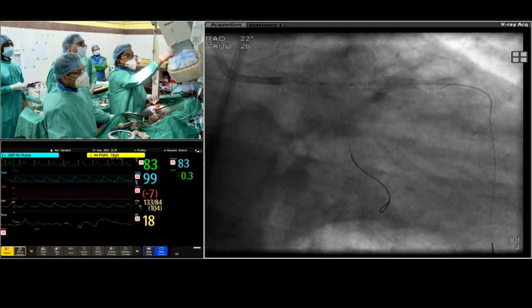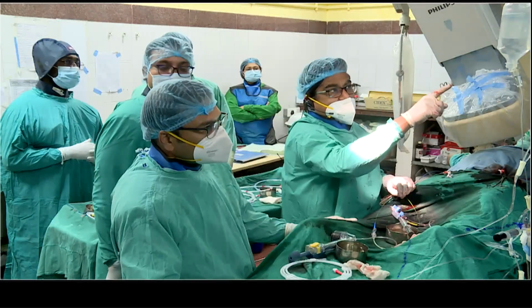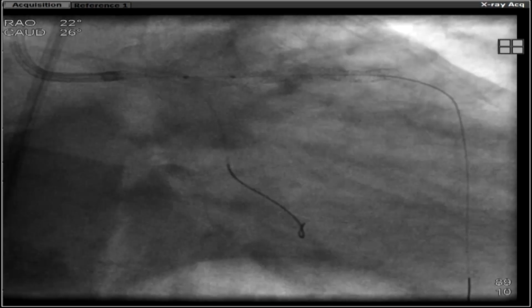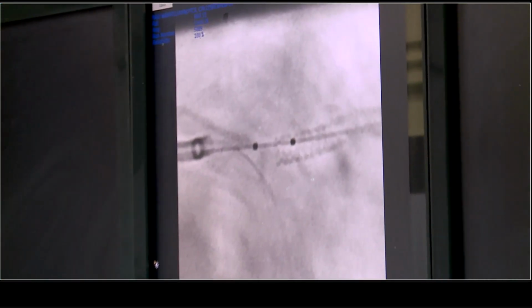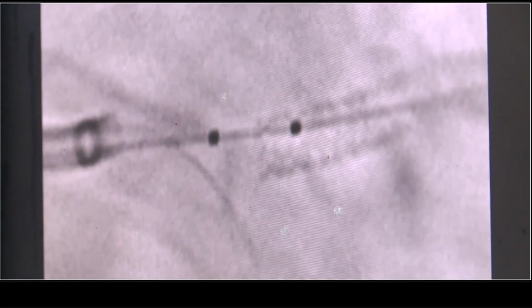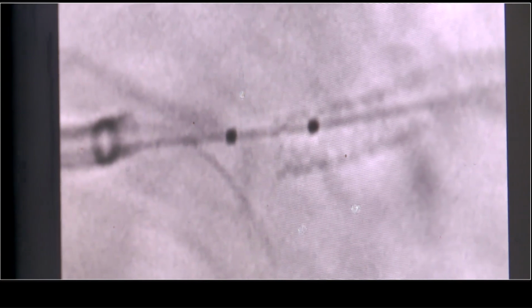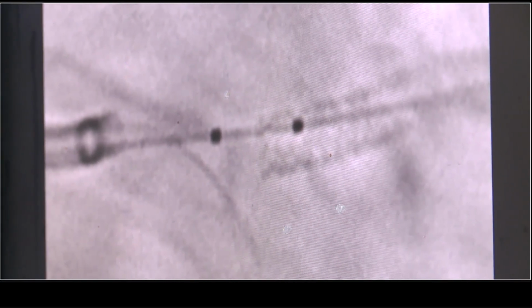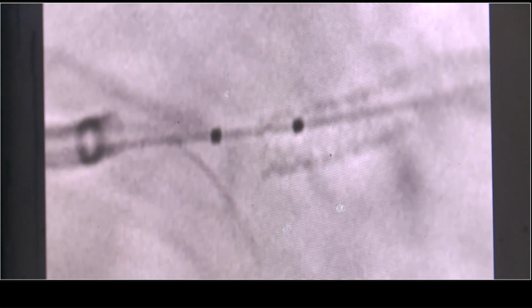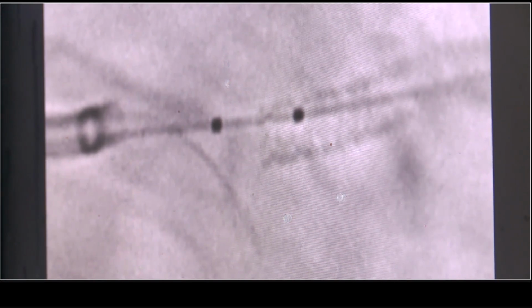Now you see the proximal end of the stent. Please focus on this camera. Show it. The gap between the proximal end of the stent and the circumflex wire is exactly the width of the circumflex in this view, at this magnification, on this frame. I have become so used to it that now I sometimes do it without a wire. But I must have done at least 300-400 cases like that with the wire there. I have also written this up as an article, but it is not yet published. It's very clear. And this is the best way to put an ostial stent.